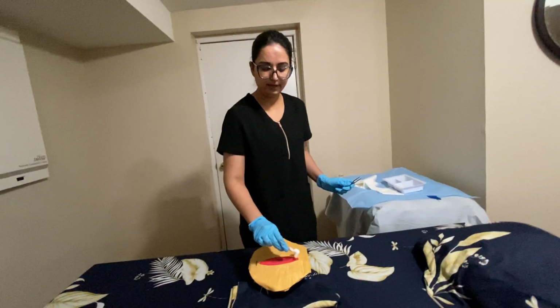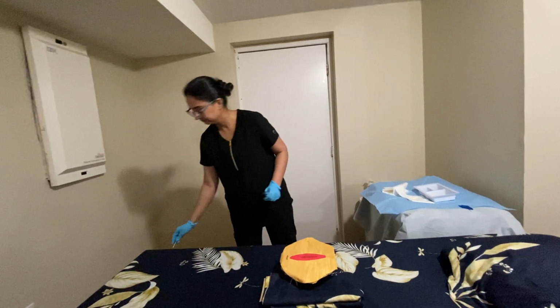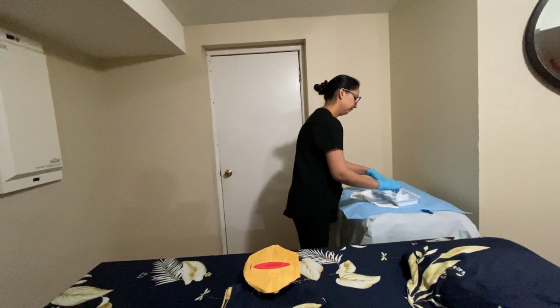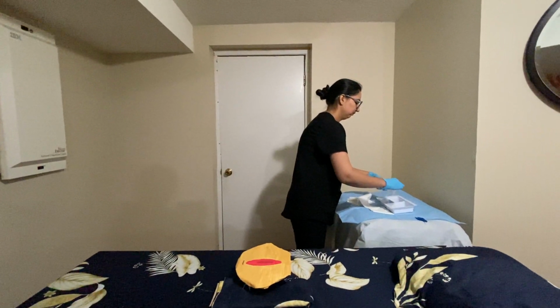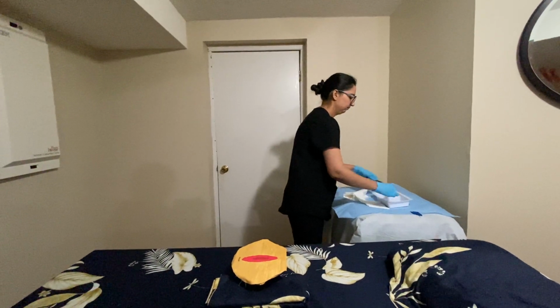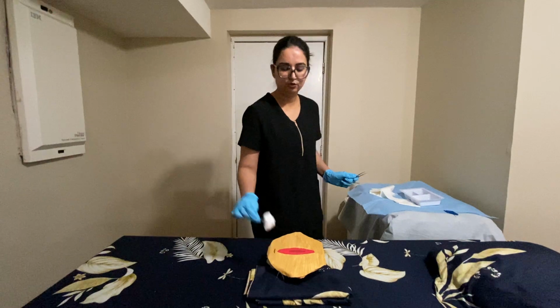Pat dry from head to toe, similarly from the midline. Now to the periphery farthest from my body, pat dry.